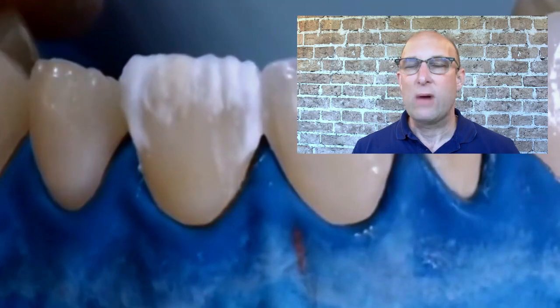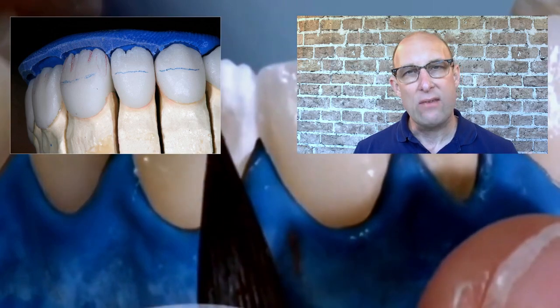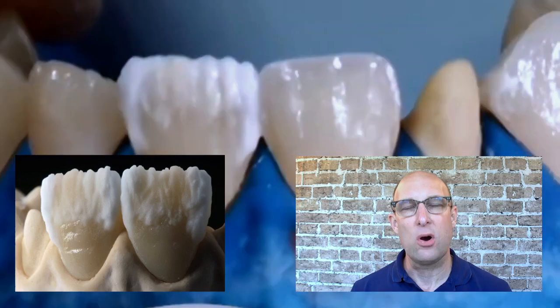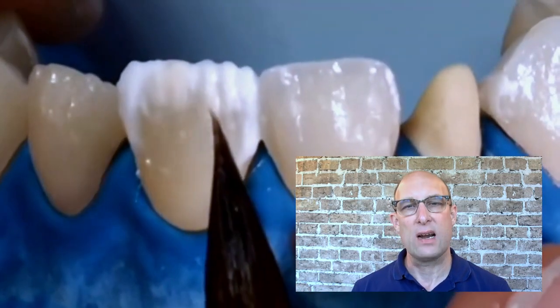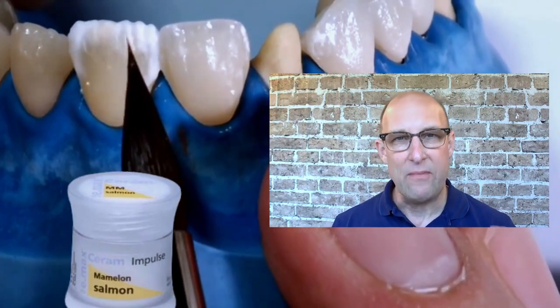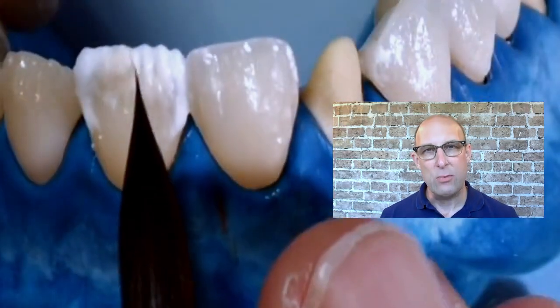In mamelon design there's no right or wrong creatively — there's only one basic rule: the upper central has three mamelons, the lateral has two, and the canine has only one. In this case I'm using Mamelon Light on the mesial and Salmon in the mid area. What also looks great is starting with Salmon in the body and feathering Mamelon Light on top into the incisal. To demonstrate this, I spread out the lower part of the Mamelon Light near the dentin and add a little Salmon, spreading it out again and then feathering it into the Mamelon Light to create a nice shade transition.